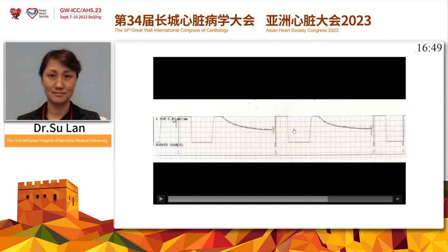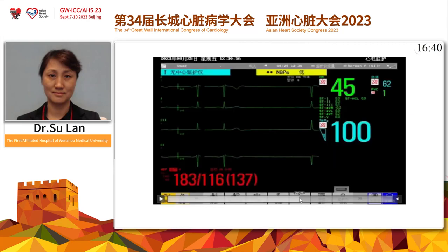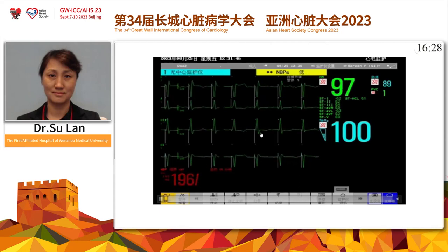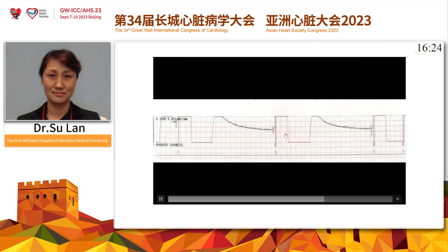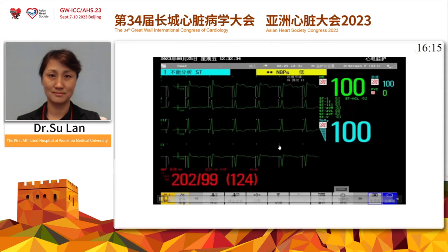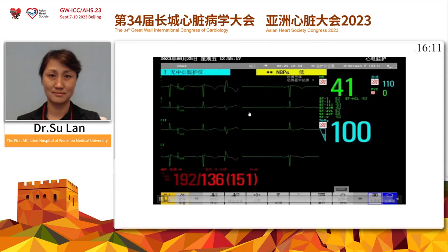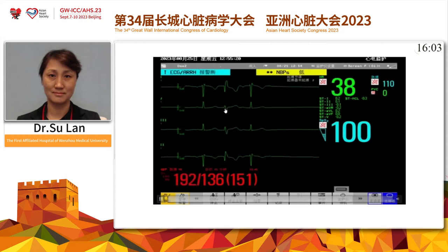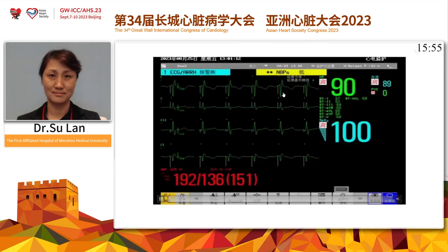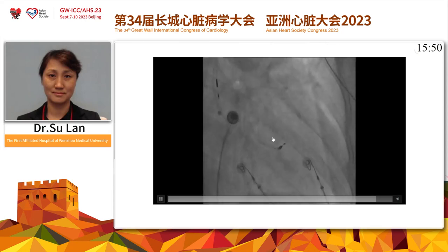I can then deep-screw the lead. In the process of screwing, we can observe the continuous morphological change of pacing parameters and the electrical depth can be monitored. During parameter testing after screwing, it is important to pay attention to the unipolar impedance and, more importantly, to change the output voltage. We can see that the LVAT after V5 is significantly shortened after high voltage output, showing capture of the conduction system — from LV septal pacing to non-selective LBB pacing.